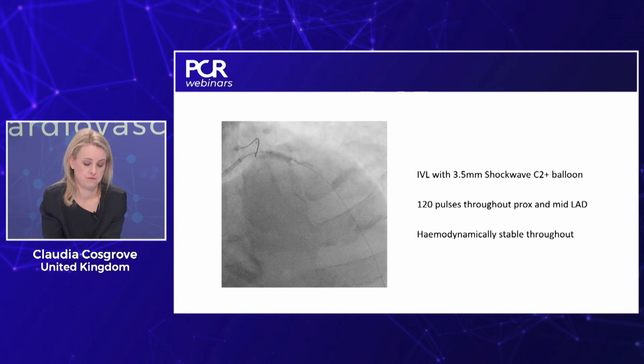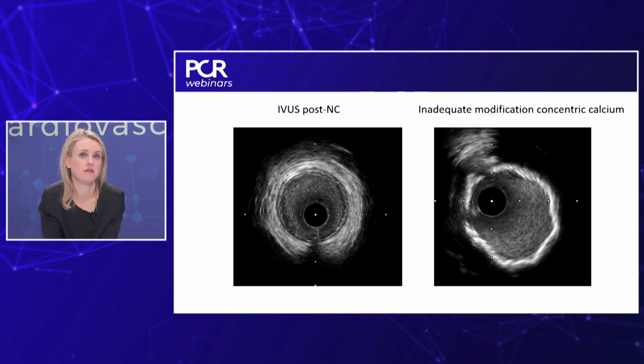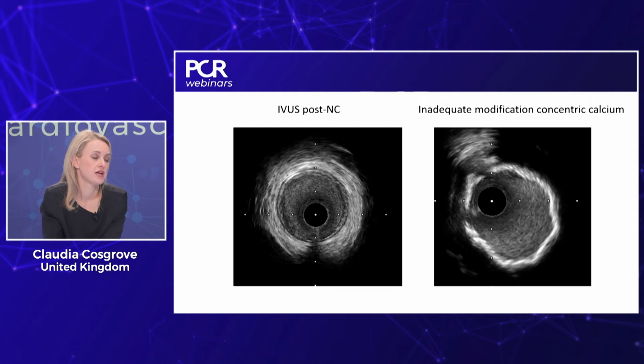Yeah, it's very clear that you have 360 degrees calcification. This normally creates problems. Not for putting the stent. I think the stent will navigate easily, but then the expansion might be non-satisfactory. Exactly. So would you go with higher pressure, bigger balloons? Are you concerned about developing low flow or dissections? Yeah, I think that would be an option, to go with a larger balloon at higher pressure, but I do worry about causing large dissections, particularly in an acute setting in the STEMI situation, and of course, again, the risk of no reflow that we've mentioned.